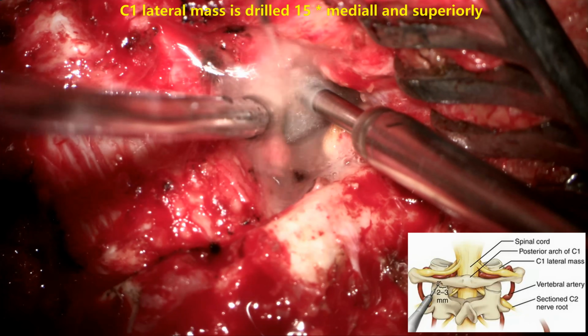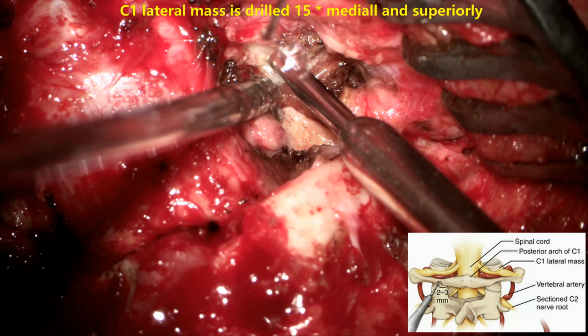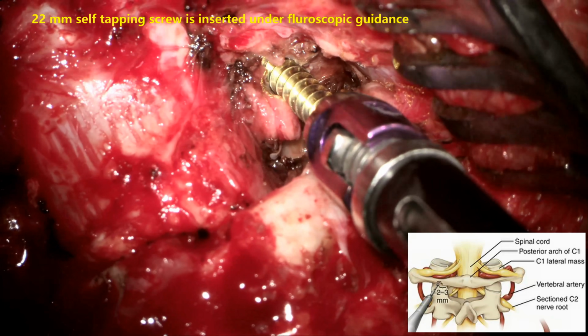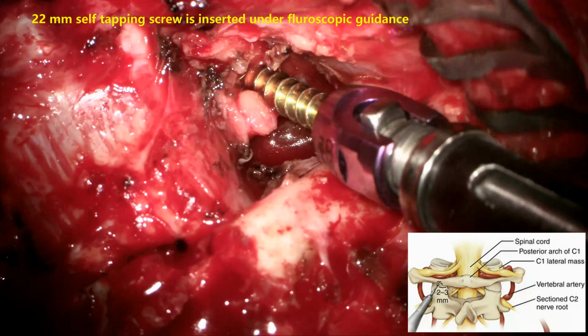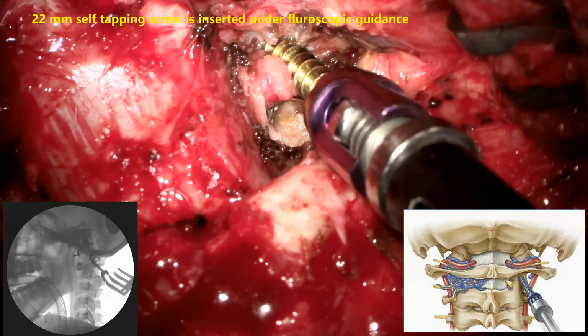Once that is done, at the inferior facet joint midline, we drill the C1 lateral mass directed superiorly and medially, and the drilling should be quite deep so that you don't have to use the tap.